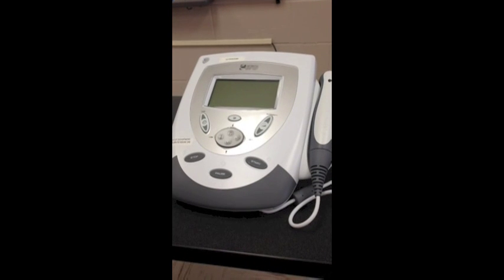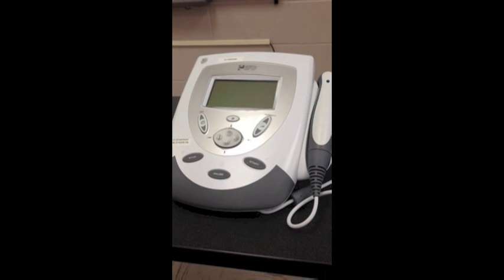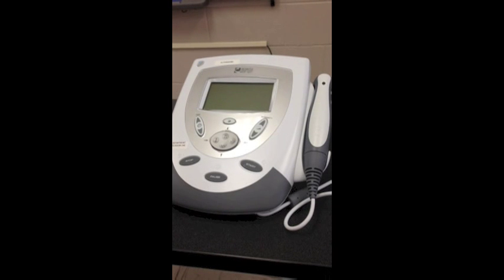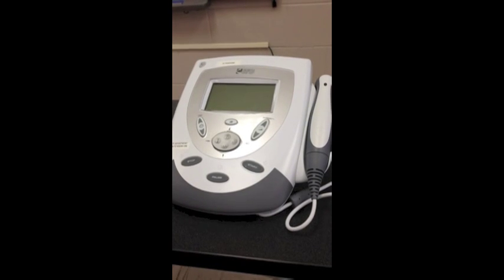Documentation. Document the frequency of ultrasound, size of transducer, mode, duty cycle, intensity, duration, frequency of intervention, size and location of treatment area, and all patient responses.